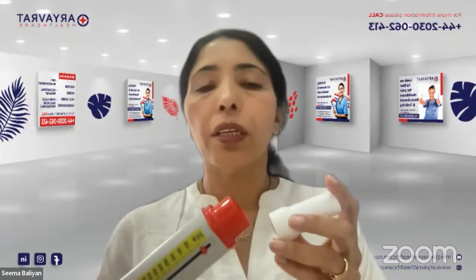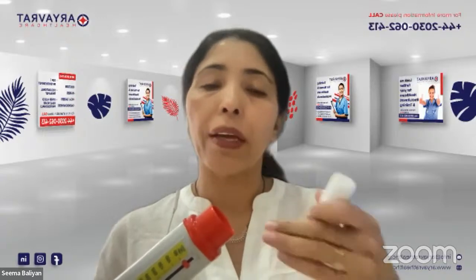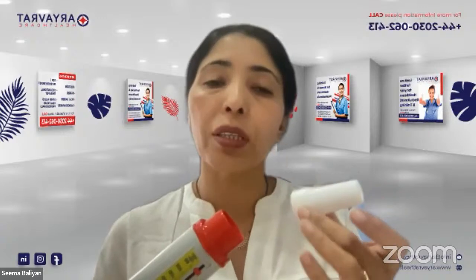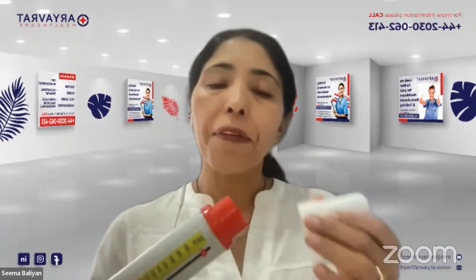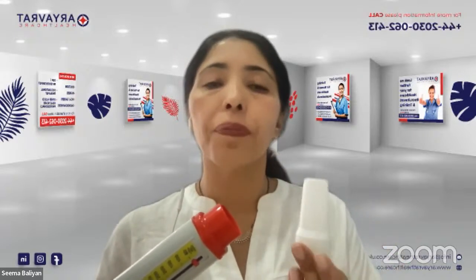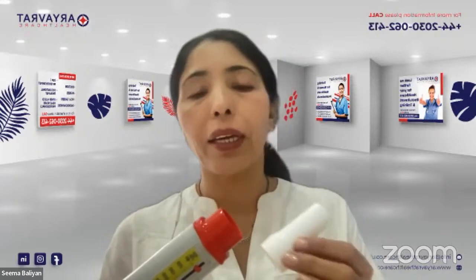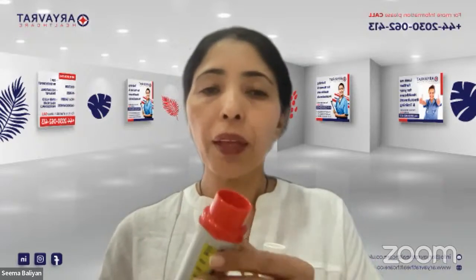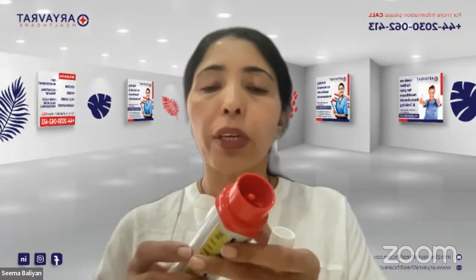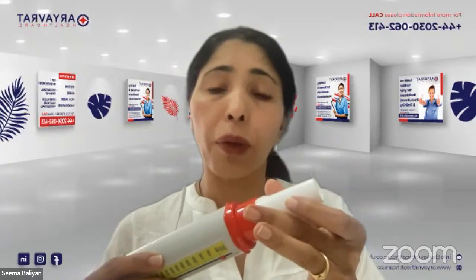So if the peak flow meter is being used in a hospital or a clinic where it is used for everyone, then you are going to be using a disposable mouthpiece so that you can use and throw. But if it is only for the patient's use, then you can give a plastic mouthpiece so that the patient can wash it and use it each time. Then there is a slot, this red colored slot, where you are going to be inserting your mouthpiece.